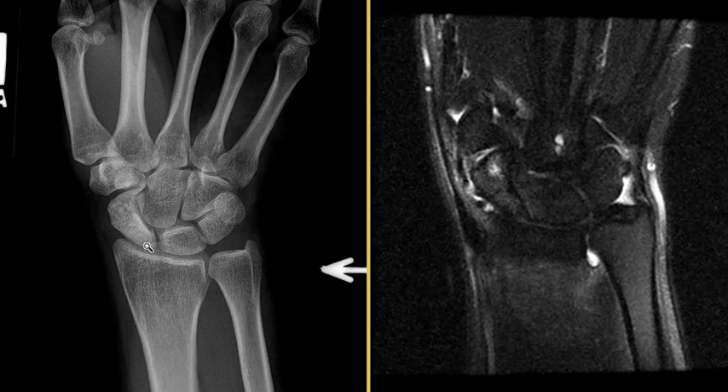This is the scaphoid bone along the radial aspect of the wrist. Normally, bones are more homogeneous, a little bit lower in density. You can see how uniform this is. This was increased in density right in this region, a kind of patchy density here, distantly. So the doctor thought maybe there was a prior injury, maybe a fracture, and did an MRI to look at that.